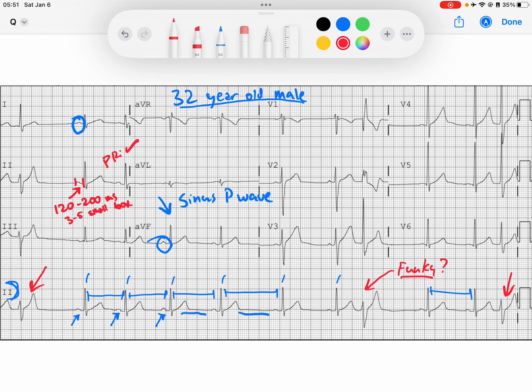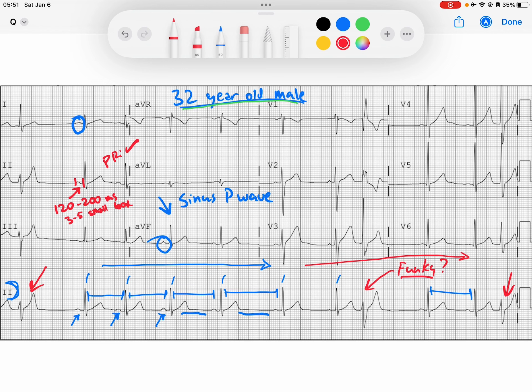I see one P wave for every QRS. And if you notice at the top of the strip, this is a young 32-year-old male. In that setting, we see the rate is getting slower and then getting faster.